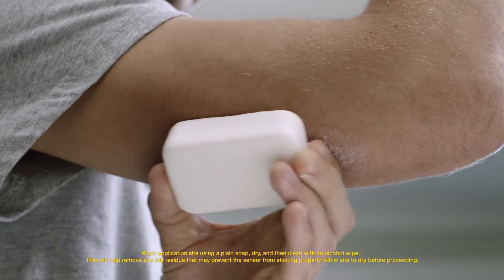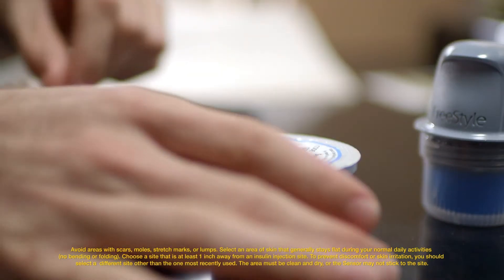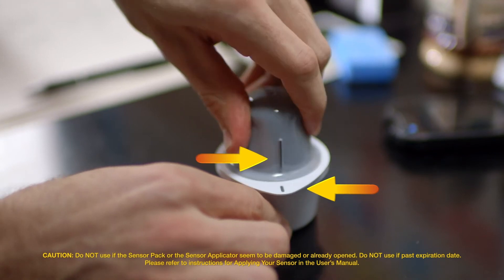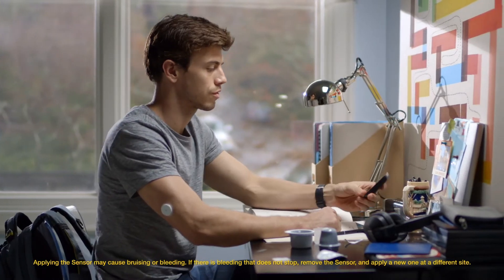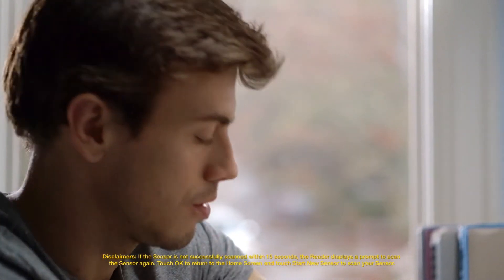To put on a new sensor, find a new site and clean it. Prepare the sensor pack and sensor applicator as instructed in applying the sensor. Apply the sensor and make sure it is secure after application. One last step: tap 'Start New Sensor' on the reader and hold the reader within four centimeters to scan it. The sensor needs an hour of start-up time — and that's how easy it is to use the Freestyle Libre system.